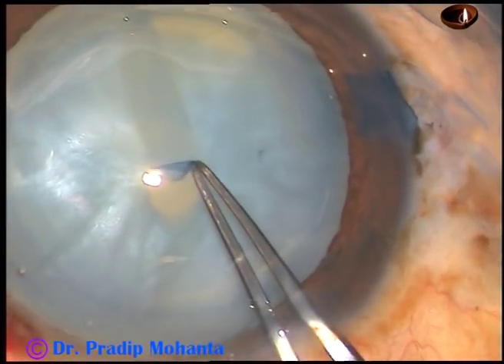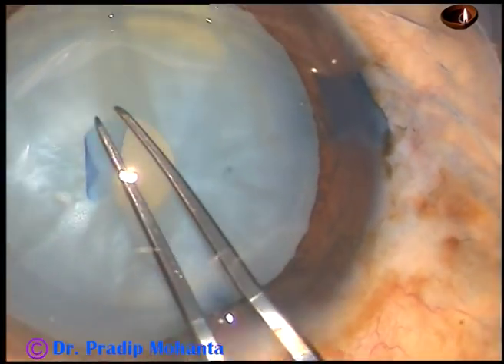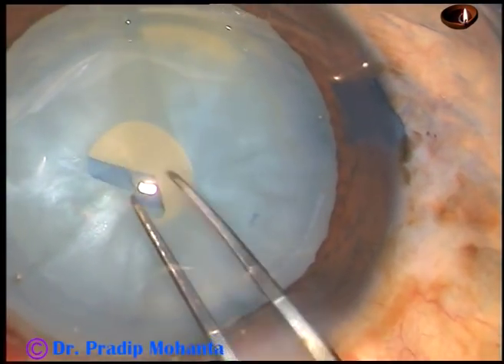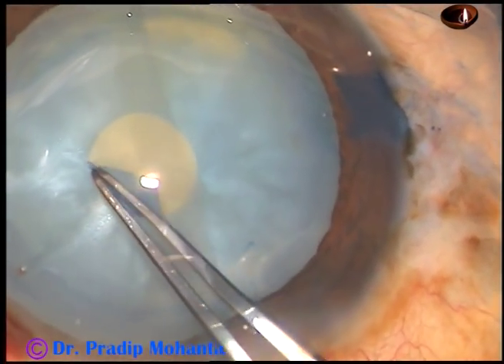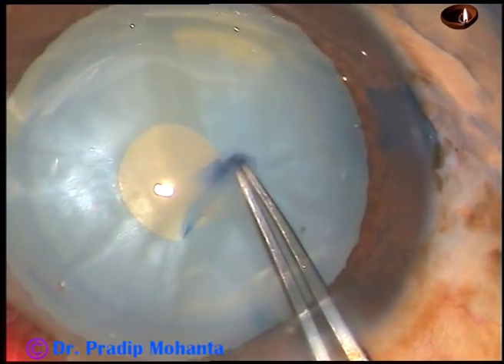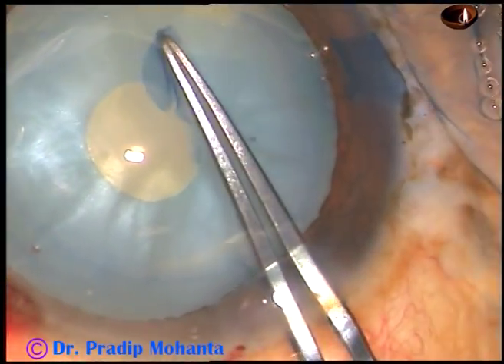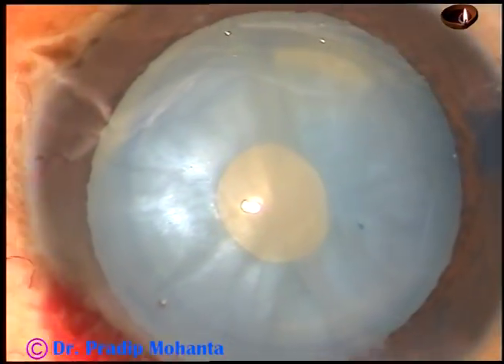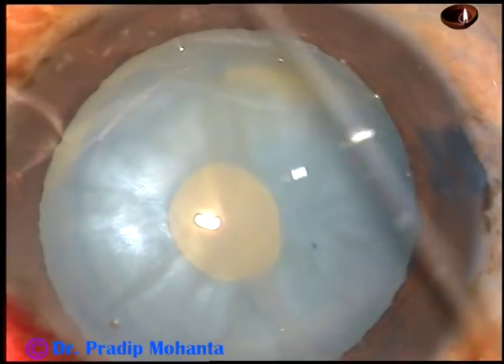And convert this C-flap into a small rhexis. And once you convert this into a small rhexis, aspirate some cortical lens matter through this opening and reduce the intralenticular pressure.